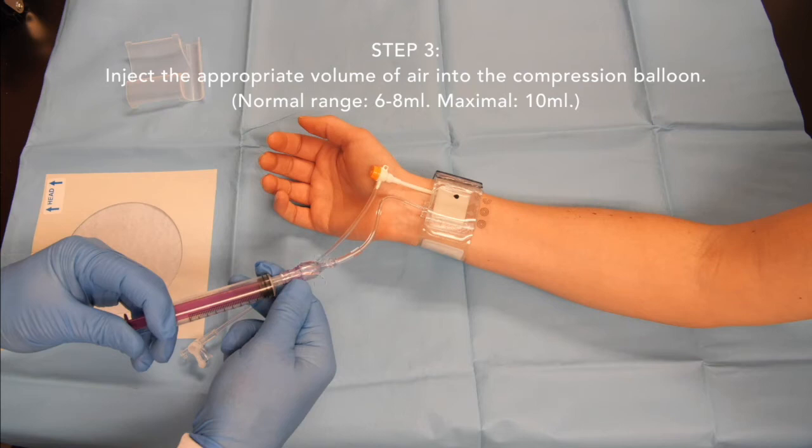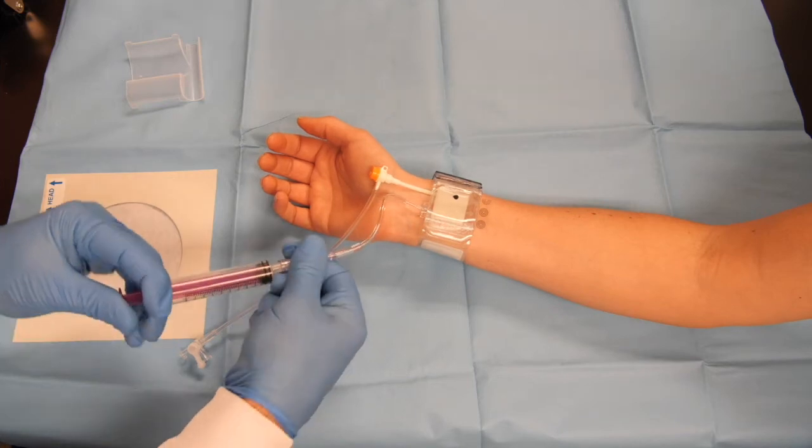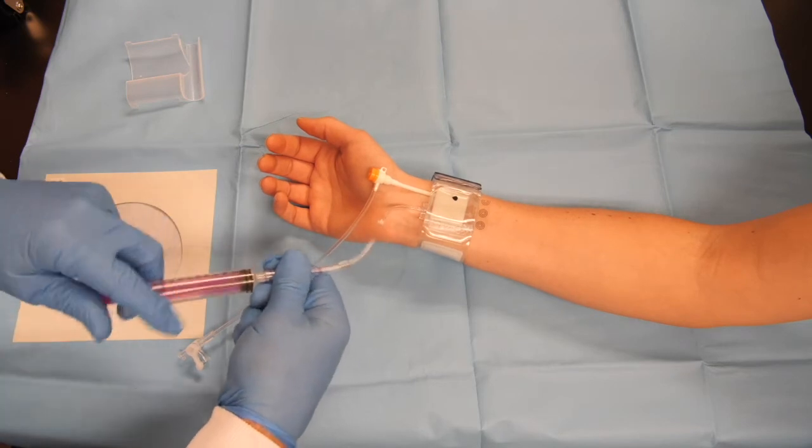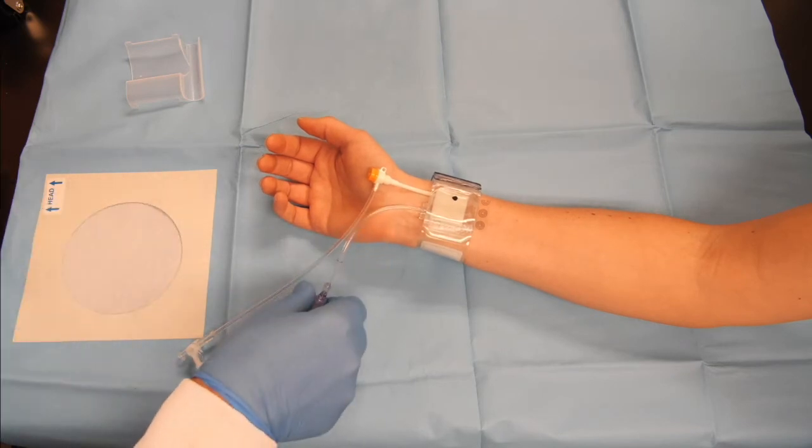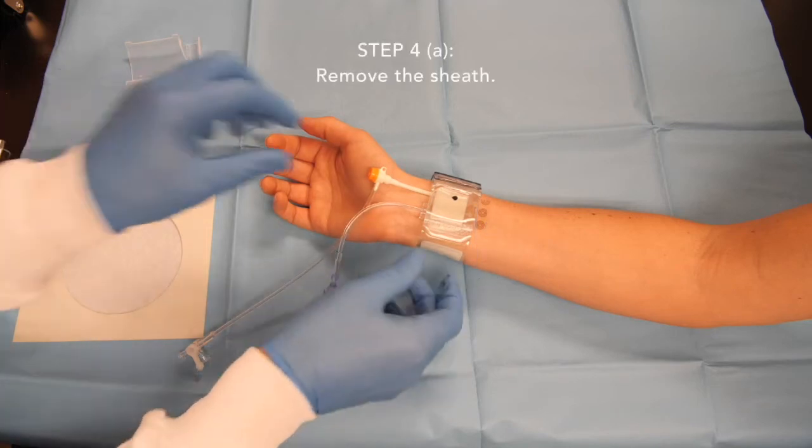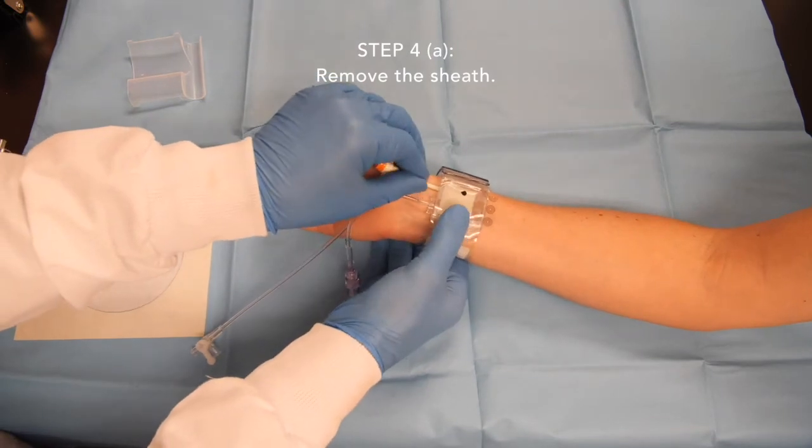Once all the air has been transferred from the syringe to the balloon, while continuing to maintain pressure against the syringe barrel, gently twist the barrel of the syringe anti-clockwise while holding the air valve steady and withdraw the socket end of the syringe from the plug end of the valve. The air valve will close to maintain the air pressure in the balloon. Remove the introducer sheath.